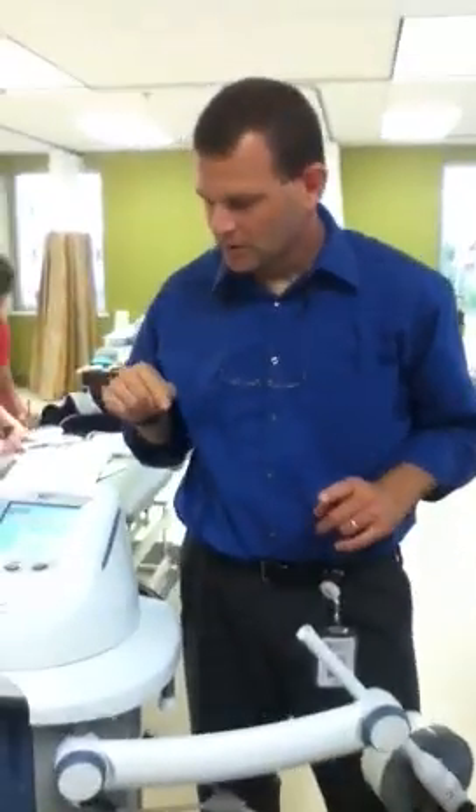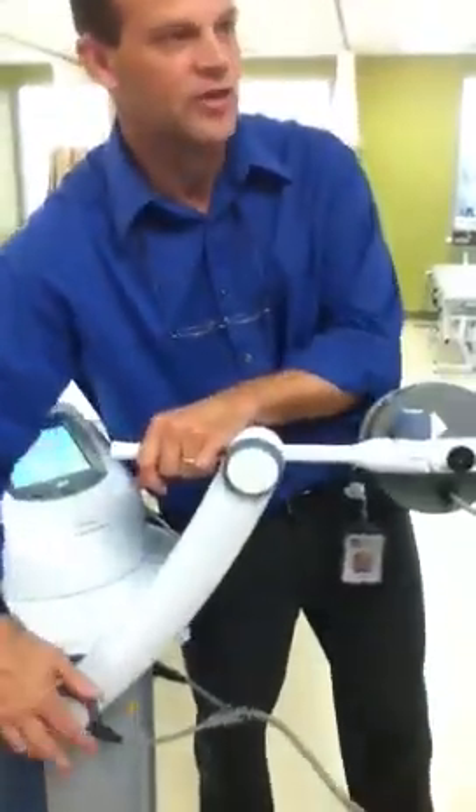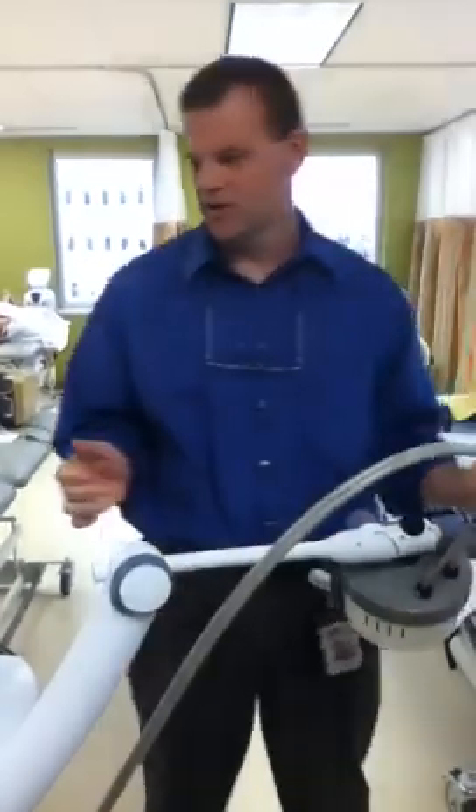I usually want just one very thin layer between the person and the head, like a t-shirt. If I'm treating a woman around the shoulder or chest area, I need to watch for underwire bras or metal clasps on the back of the bra. For the coils, I usually lay a towel down and then lay the coils on the towel. I'd push the head right up against where I want to treat. These are good for shoulders because it gets in and around, penetrating well. This machine has four points of adjustment — I can move it to reach just about any position I want.